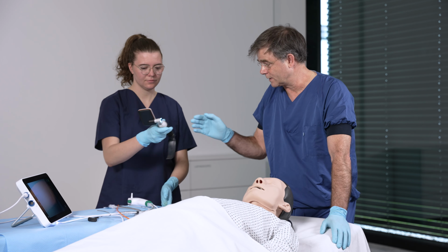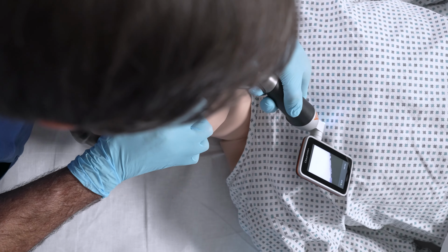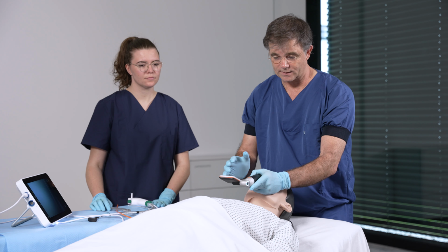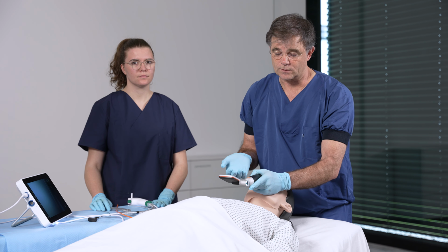I'm on call as an anesthesiologist. They call me to the ICU and the patient needs an urgent intubation. So my assistant will give me a laryngoscope, and then I will put in the video laryngoscope. Obtaining a view in most patients is not that difficult because the companies have made such beautiful equipment that the cameras can look around the curve.